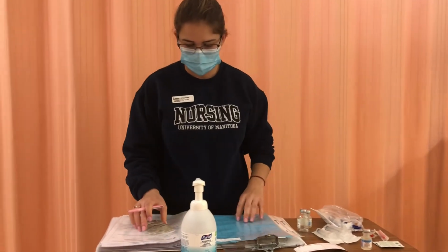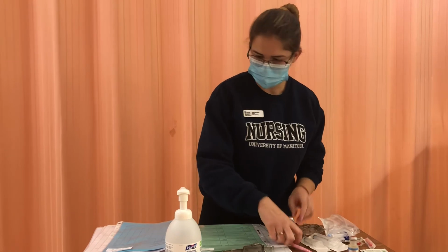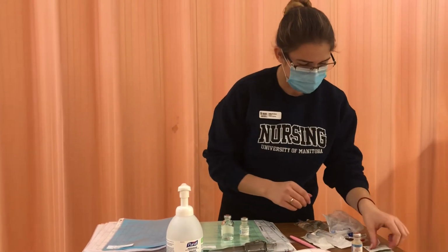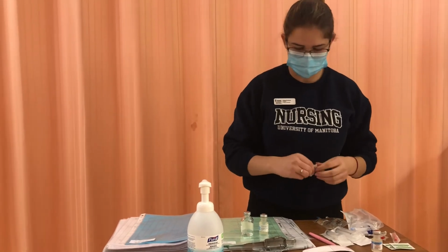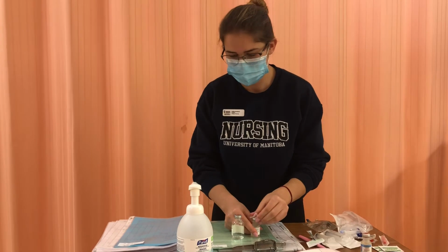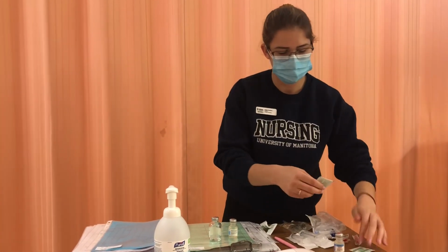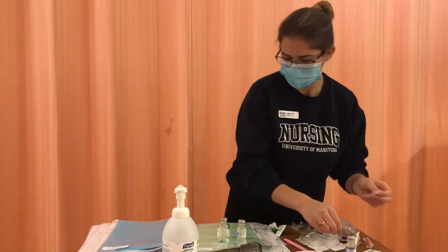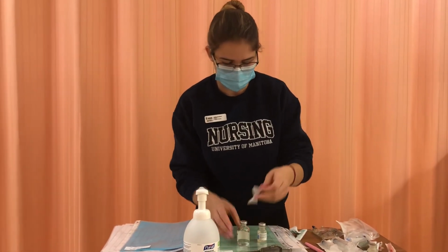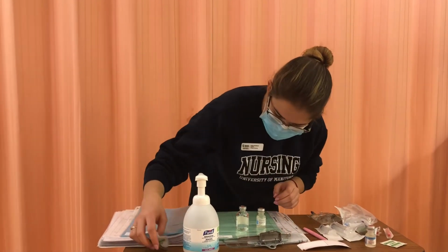So now I'm going to start going over and setting up my meds. I have my sterile water and my cloxacillin, so I'm going to clean the tops of each vial for 30 seconds. So 30 seconds has passed. Okay, so I'm going to throw that out. I'm going to open a new alcohol swab, and I'm going to clean the top of my cloxacillin. So 30 seconds has passed, and that's all clean. So both bottles are clean now.